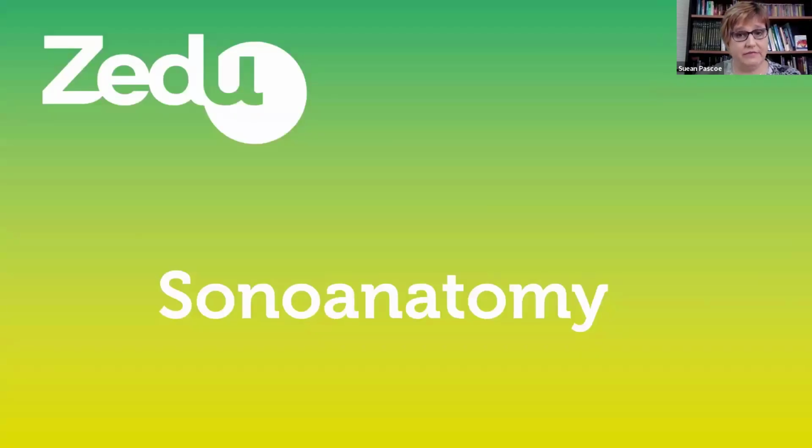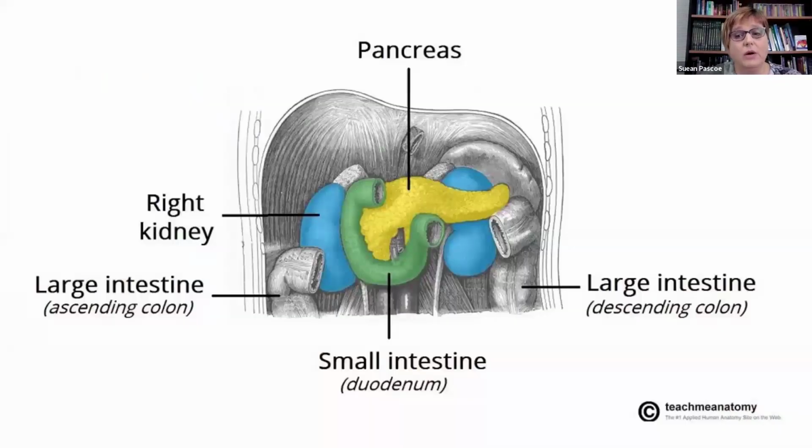So, up front, the sonographic anatomy. The pancreas is an oblong-shaped organ positioned at about L1 in the transpyloric plane. With the exception of the tail of the pancreas, it's a retroperitoneal organ, and it has several direct anatomical relationships to the things around it. The duodenum is the trickiest, as it's this C shape that curves around the head of the pancreas and can hinder our visualization, because if the duodenum has gas in it, we can't see through that so well. The common bile duct also descends behind the head of the pancreas before opening into the second part of the duodenum.